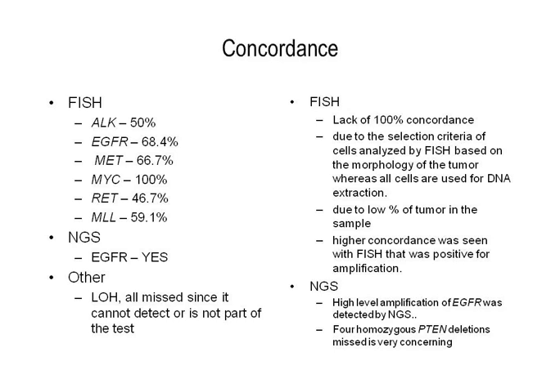Shown more here, this is the summary of our concordance studies. So we could see the FISH detected amplifications, and it was not 100% concordance, and we think mostly it could be because of the low tumor burden of the sample and different sampling issue, but also we think that it is due to the fact that the NGS captures the total DNA and FISH is done on marked area based on the morphology. And we're further doing more studies with FISH probes specific to the ones which we saw in OncoScan.